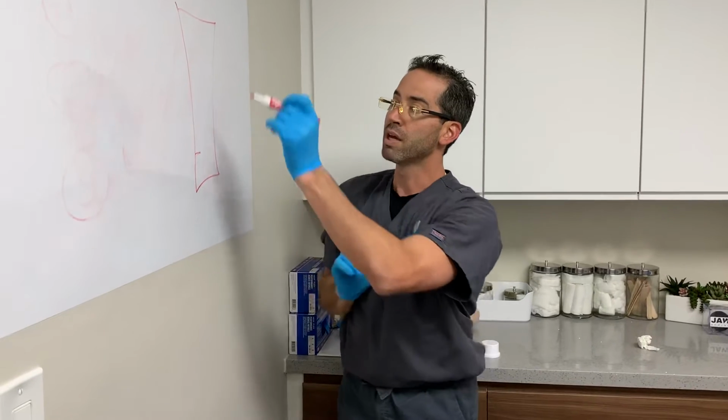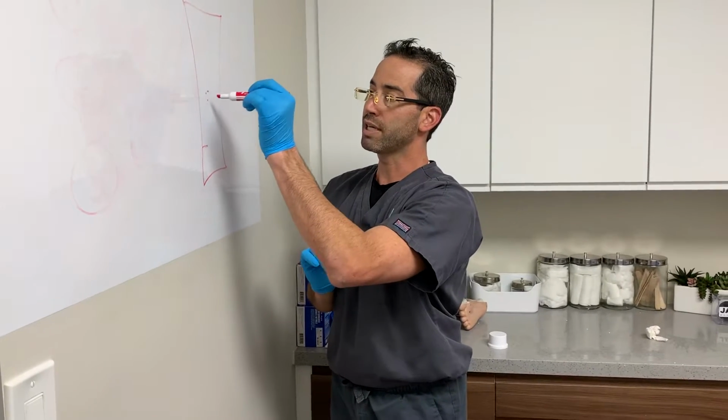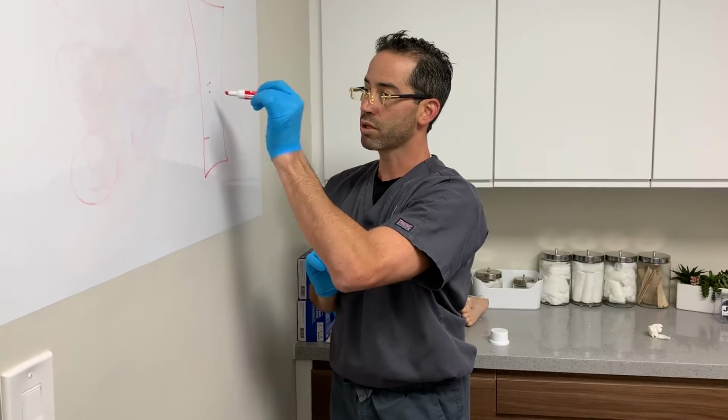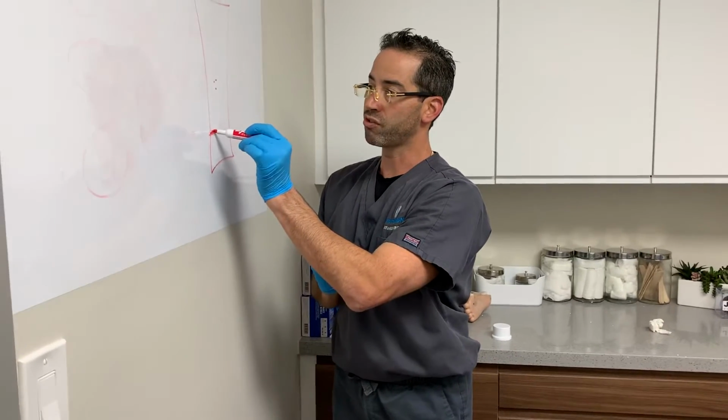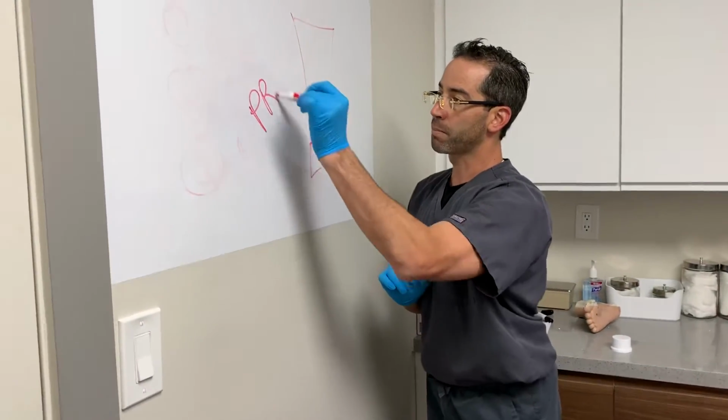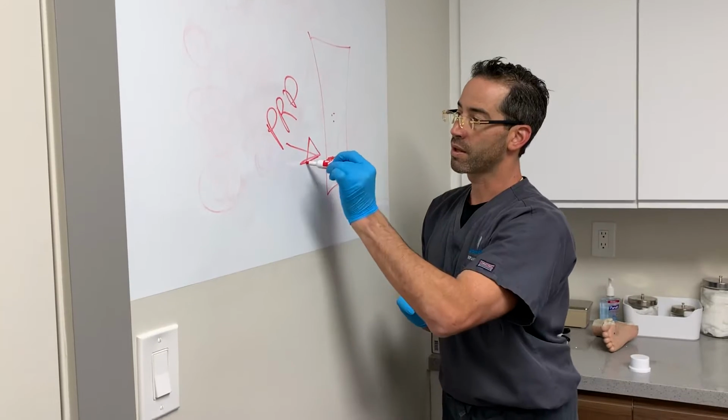I just want to say something. This procedure we do here in our office-based surgical suite under local anesthesia. We not only do this, which is where we snip the little ligament a little bit, but we also implement the PRP there.